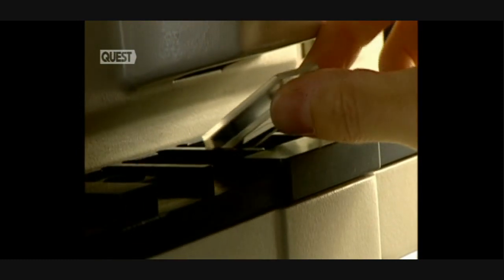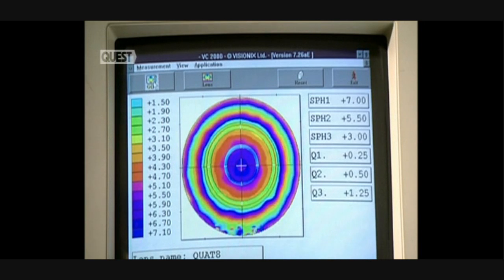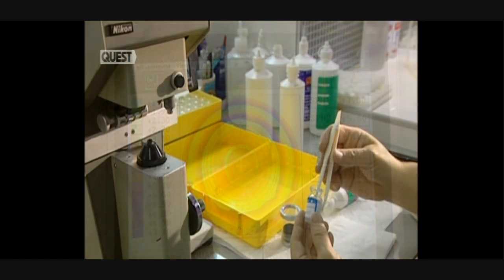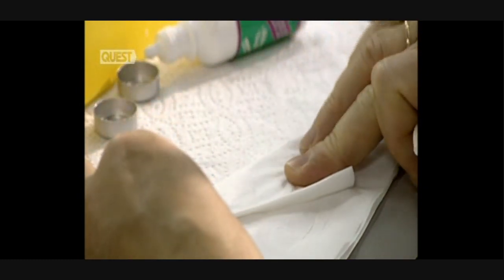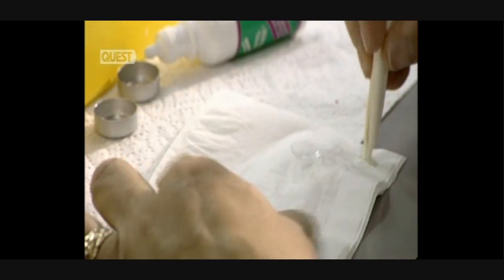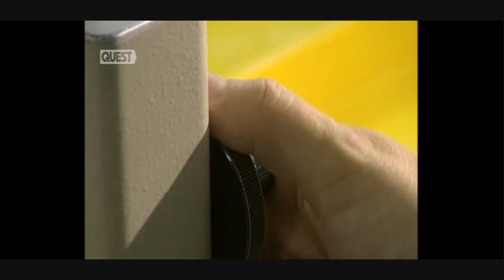Next, the lens is checked. An optical topographer is used to verify whether the spread of the optical power in the lens is precise enough. At every step, the soft, fragile lenses must be handled with the greatest of care. A unit called a frontofocometer — a metering device — verifies the optical precision of the lens.